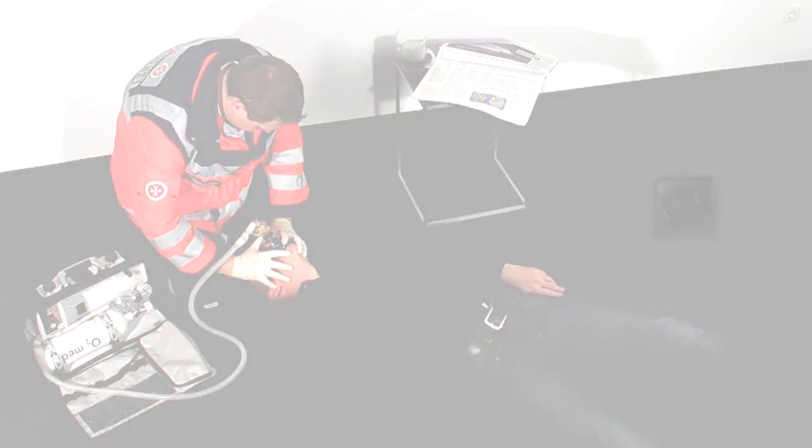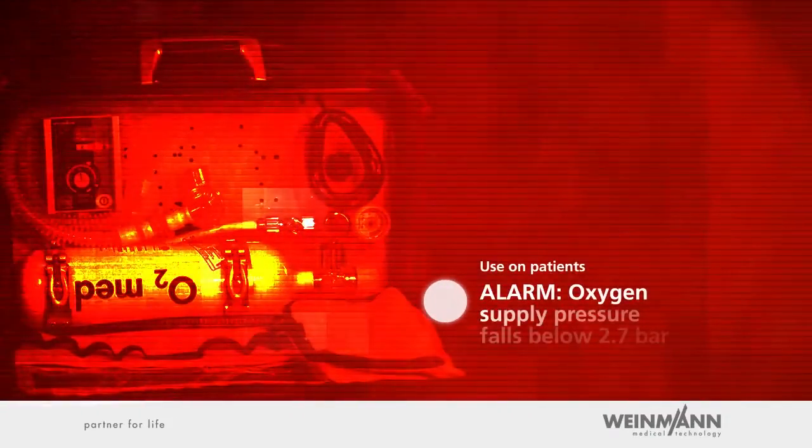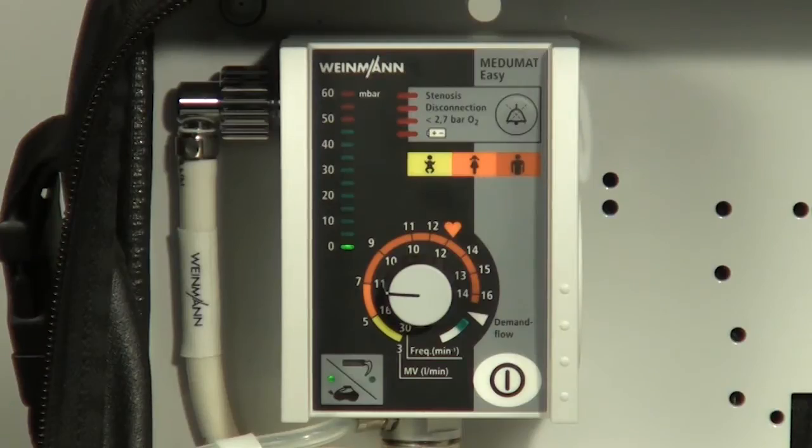Always keep your eye on the gauge of the oxygen cylinder during mechanical ventilation. When the oxygen level of the cylinder is at about 50 bar, make sure you have a full cylinder on hand to replace the nearly empty one. Never empty a cylinder completely — otherwise, moist air can get into the cylinder and cause corrosion. Alarm: if the oxygen cylinder empties to a point where pressure falls below 2.7 bar, Mejumat Easy will immediately issue a visual and acoustic alarm.